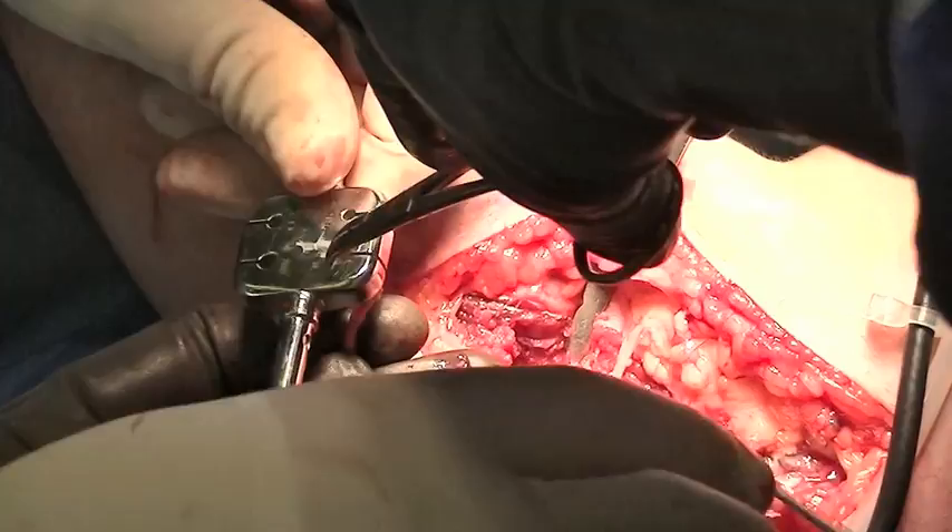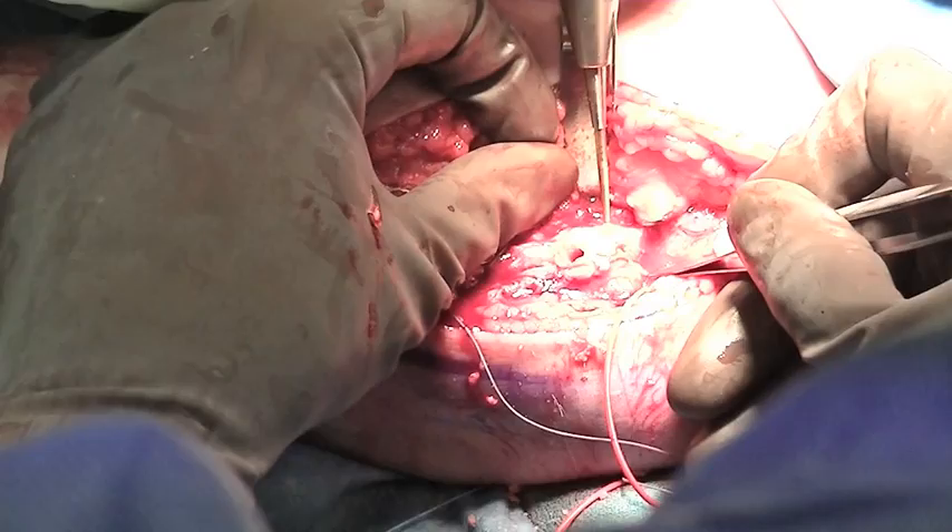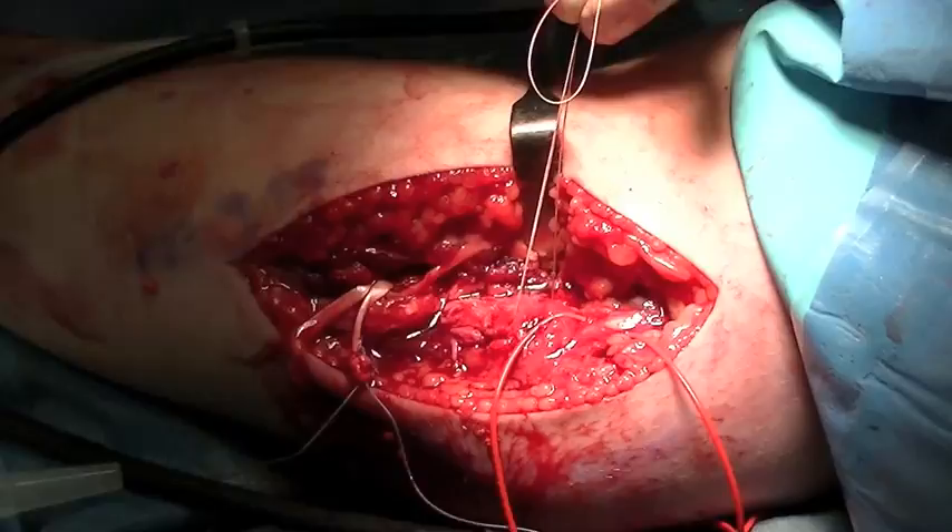The cannulated drill is used to prepare the guide holes in the distal humerus. First the guide wire and then the cannulated drill is used to make the distal drill hole. The proximal holes with a 2 mm cutting burr are then made on either side, so that the sutures can be passed for passing the proximal tails of the autograft as shown here.